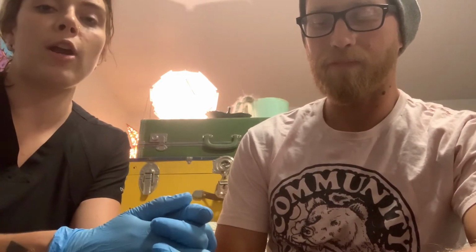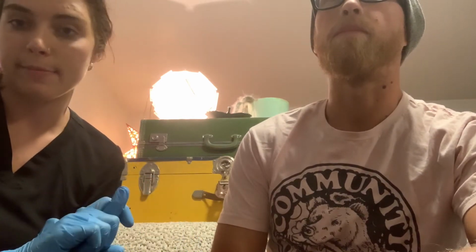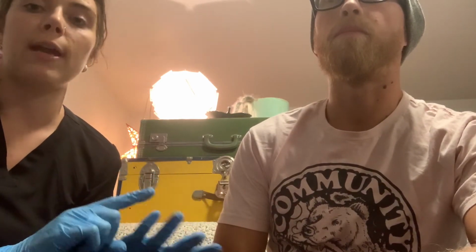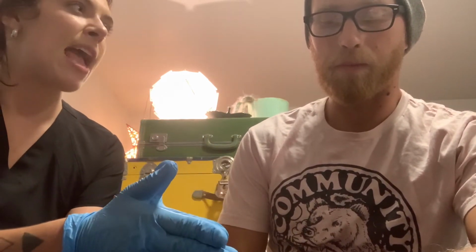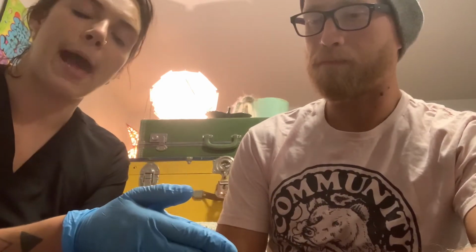Alrighty, so today I'm going to be assessing a vein and selecting an appropriate vein for intravenous therapy on my lovely volunteer, Chris, here. Before we begin, I would be looking in his chart for any indicators that may help narrow down the IV selection, such as has the patient had a mastectomy, a stroke, paralysis or a dialysis shunt, and I would be wanting to make sure that I was selecting the opposite extremity. My patient doesn't have any current medical history that matches this.